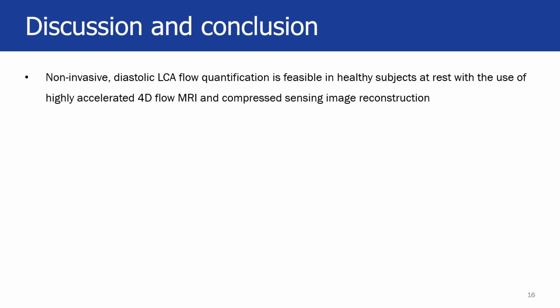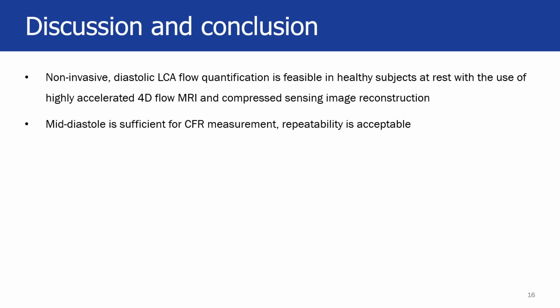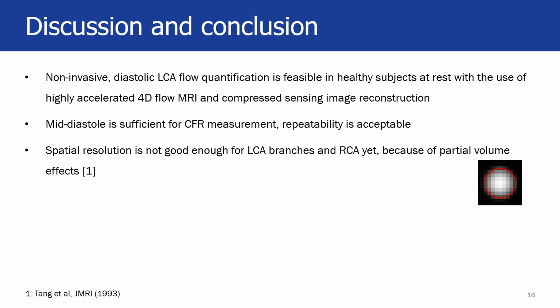What we can conclude from this study is that non-invasive quantification of diastolic LCA flow is feasible with the use of highly accelerated 4D flow MRI. We were only able to measure during mid-diastole, but this is sufficient for CFR measurements, and our results indicate that the repeatability is acceptable for this purpose. The spatial resolution is not good enough for measurement in the smaller LCA side branches and the right coronary artery yet, because of partial volume effects.